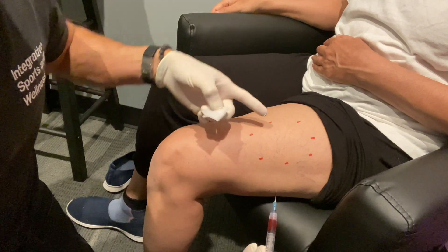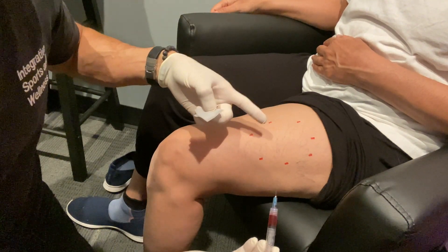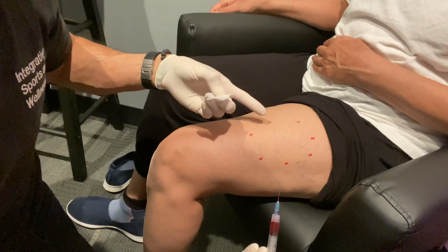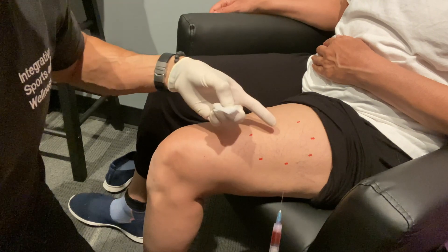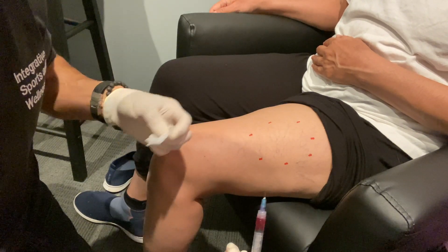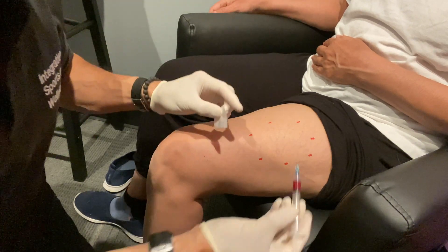As far as getting into the muscle, it has to be straight down and perpendicular. What I mentioned to Mrs. D is that if we wanted to, we can actually freeze this with ice — just have to be careful about frostbite. It cools the skin down so you don't feel even the needle. But after the ice, you mark the spot, then you clean. By the time you do all this stuff, the cooling effect might be gone. Okay, slow deep breaths.